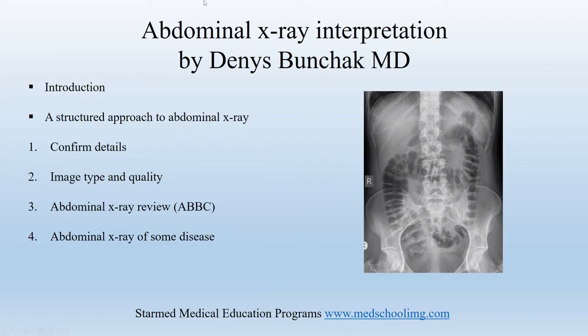So the structure of today's lecture is the following. We'll start with a small introduction, then there is an approach to the abdominal X-ray, the steps like confirm details, assess image type and quality, and then assessing the X-ray with the mnemonic ABBC.